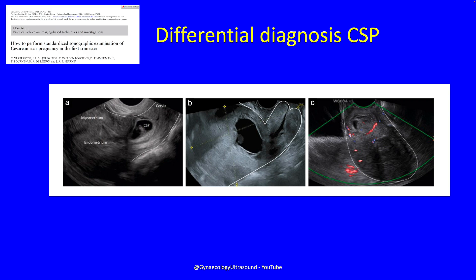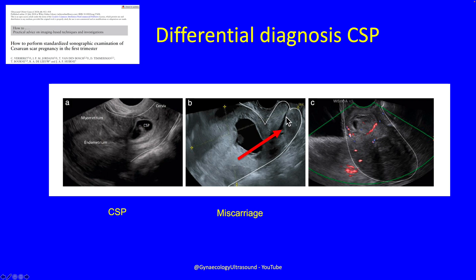The differential diagnosis of a scar pregnancy is a miscarriage and a cervical pregnancy. This is a scar pregnancy where you can see it is embedded above the internal os. In a miscarriage passing through, there will be a positive sliding sign — when you press gently it will move — and a negative Doppler because the trophoblast is not implanted. In a cervical pregnancy, if the pregnancy is below the level of the internal os it's a cervical pregnancy; if it's above the internal os, it's a scar pregnancy.